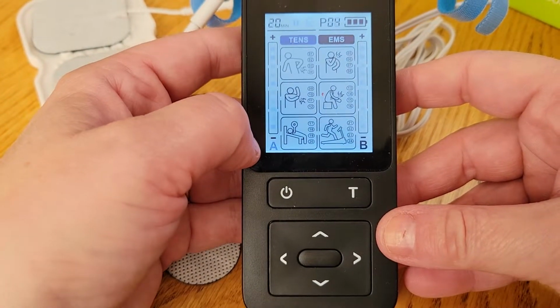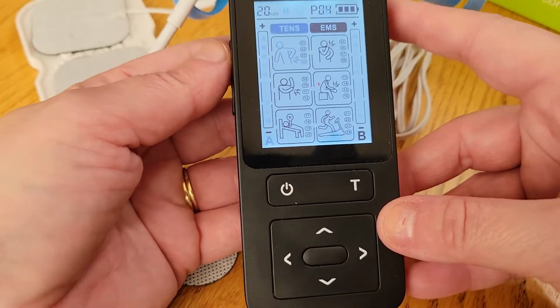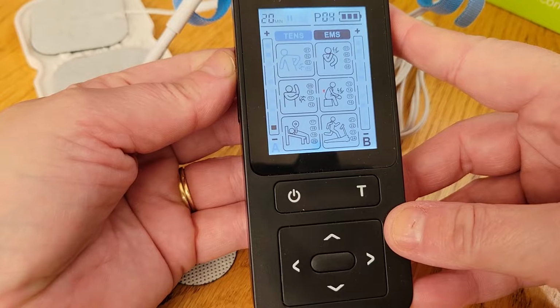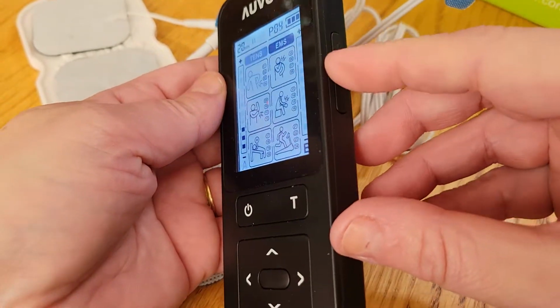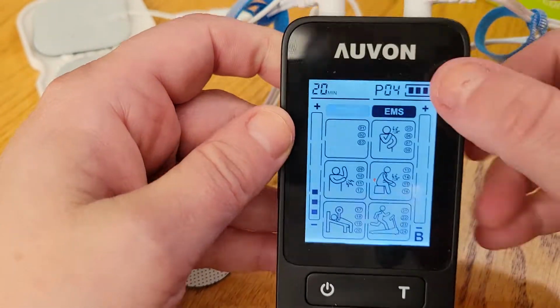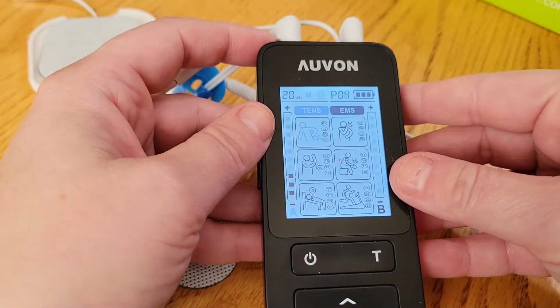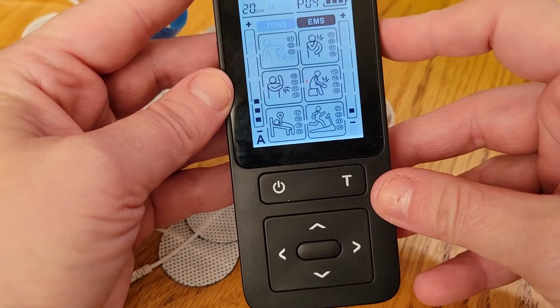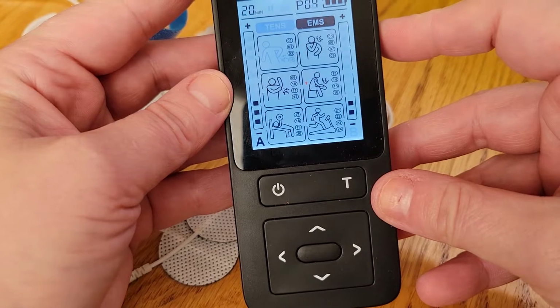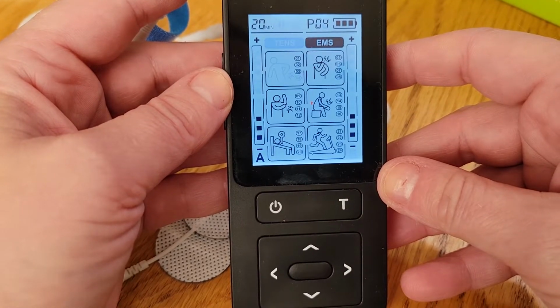Okay, and we have A blinking over here, and as you can see, it's on 4 for the mode. And you could turn that one up. And then over here is where you would turn up the intensity on B. So that would be the square pads that I just put on. And turn those up. And that's as simple as it is to use.